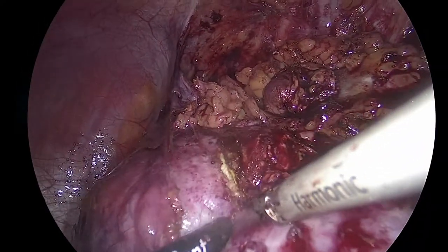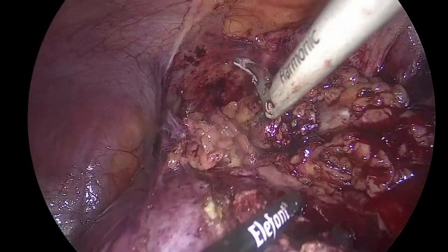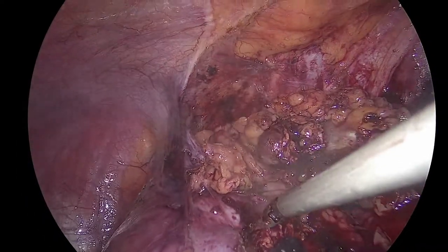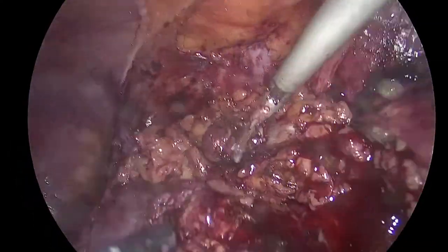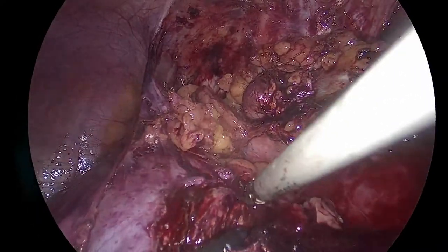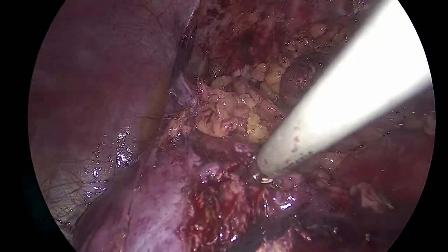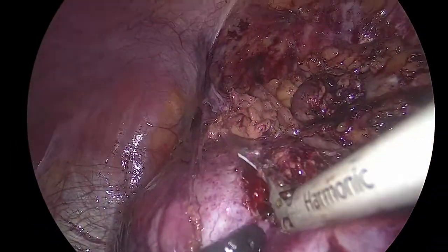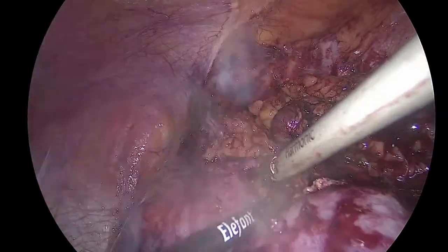Hi, Evangelos. Yes? It's Katie Sievert. Why are you not going for a frozen section of the tumor and take it out instead of taking the kidney out of... By the time frozen section comes, we will have cut it anyway here, so since there is this doubt, I don't see why we need to wait. Come in. I think it is all out. But we will see. Will be interesting to know.